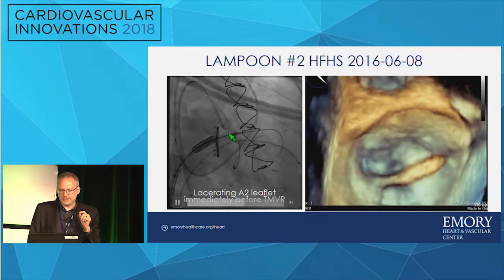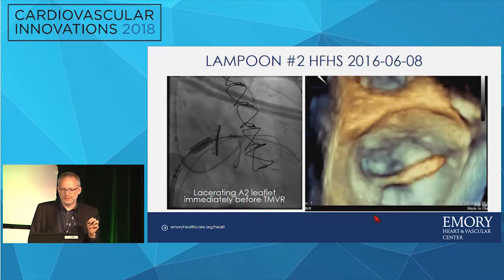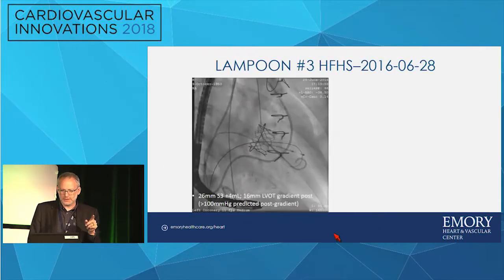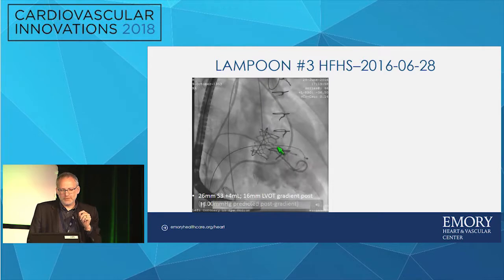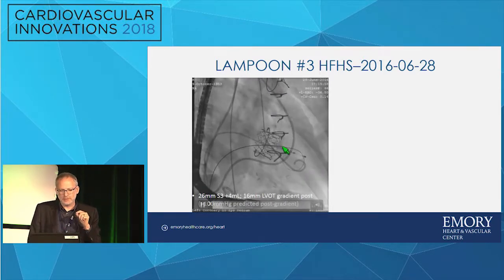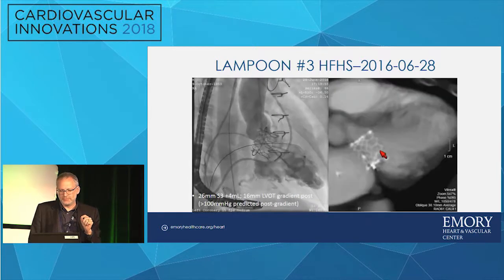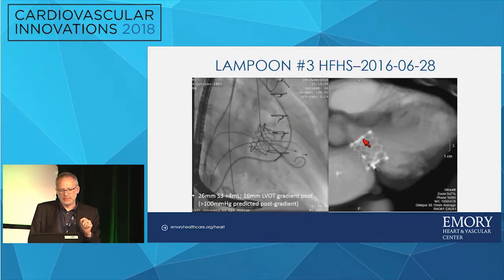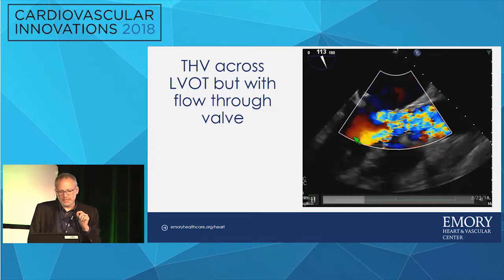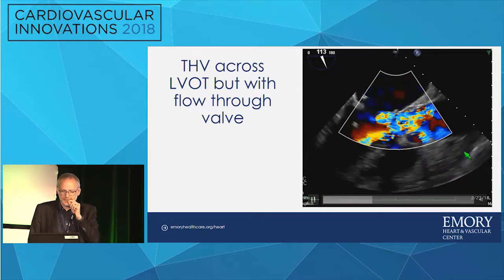So here's what it looks like. Here's the pull, and here's what the split looks like. These people do well hemodynamically because the leaflets still coapt normally as they do in the aortic position. And this is what the V-gram would look like. One didn't do a V-gram on the first patient, so this is actually the second patient I did, number three in the world. The valve can be completely across touching the septum, and flow will now go through it. This patient clearly would have obstructed otherwise. And here you'll see on the LVOT view from TEE, you will see the cage coming all the way across, but you will see flow through the cage.